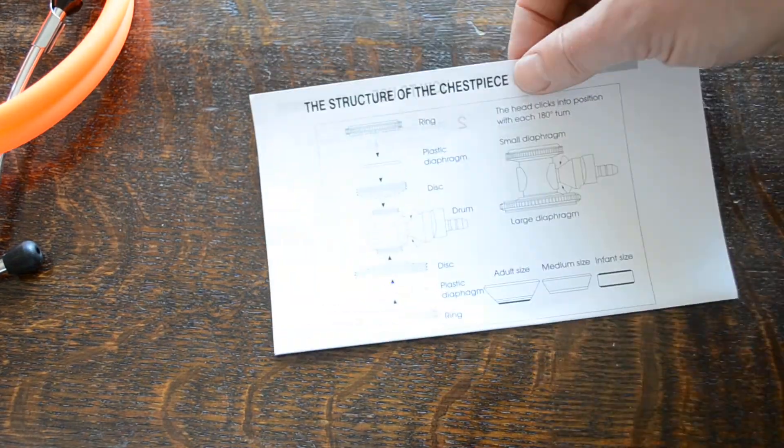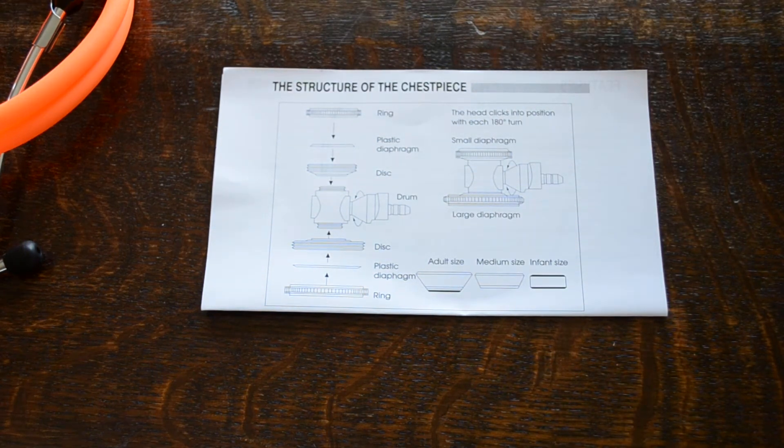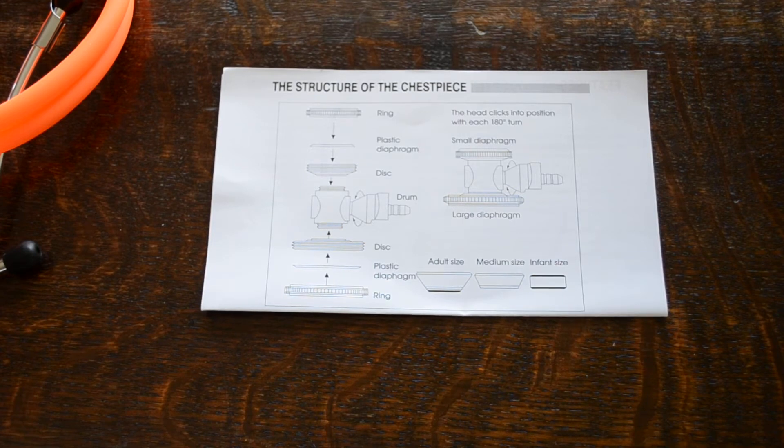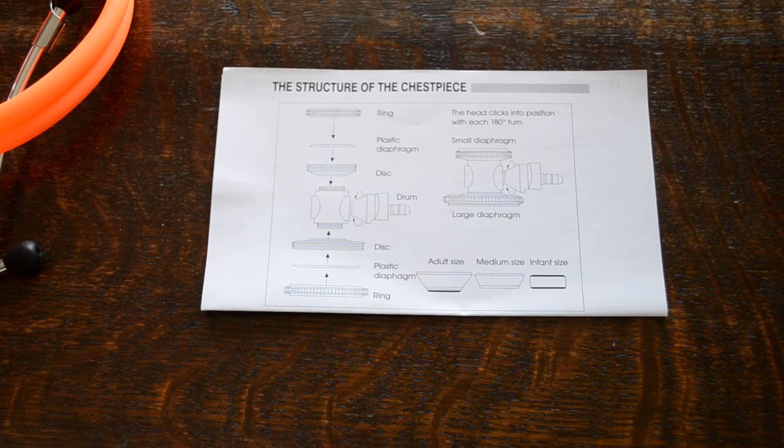Let's just close that up for you and just show you the structure for the chest piece guidance on here. Now Sprague's offer basically a choice of how you can have them set up. It's a matter of personal preference, but it gives you a five in one option basically.